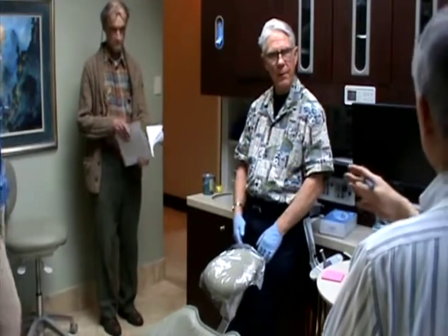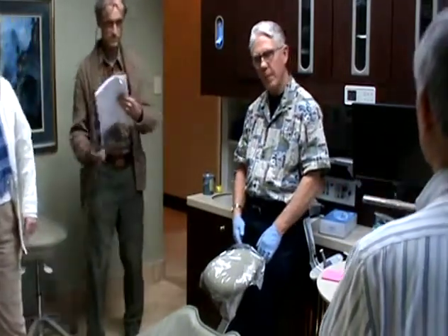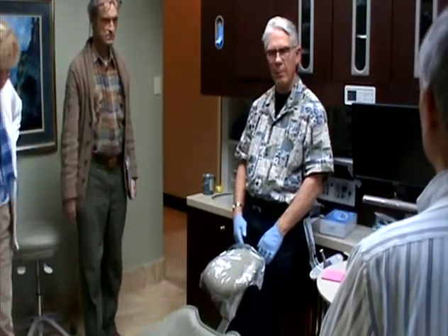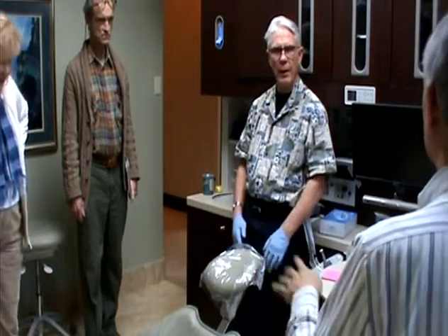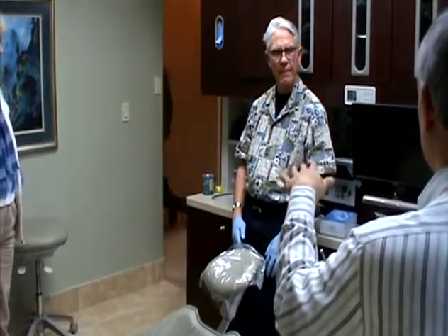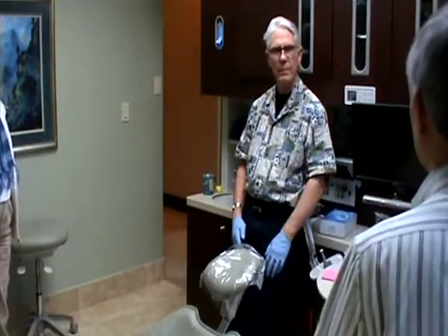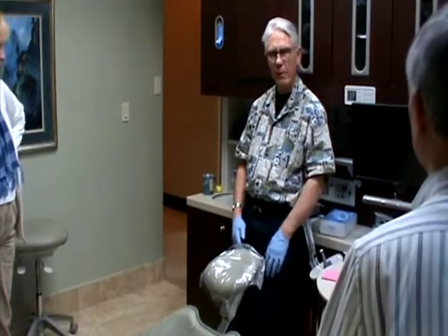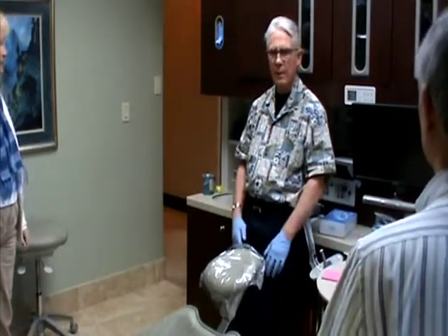You do composite when you want to make it long term. When you get to the point where you know they're not gonna change a whole lot, then I go to the composite. Because in the initial stage, if you have to change it, it's harder than heck to keep grinding that composite. They may be in the composite part for a year. The hard splint with the Super T is about 6 months, roughly, until I know they're not changing.